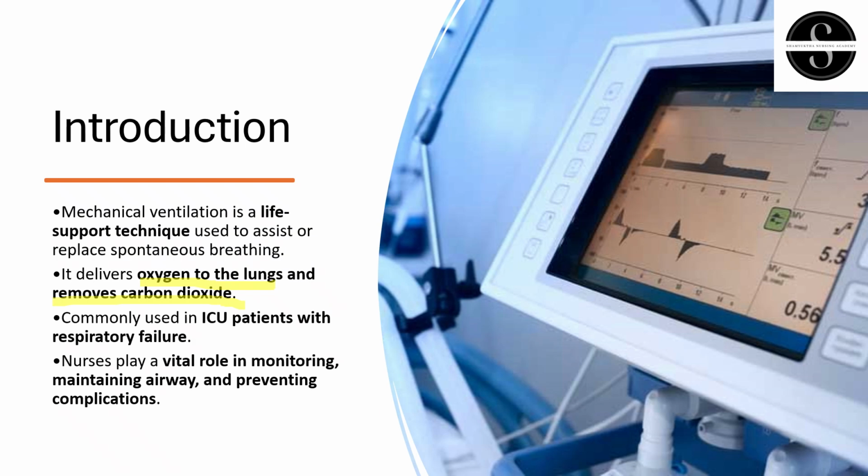It is commonly used in ICU patients with respiratory failure. In the ICU we have critical patients, right? Nurses play a vital role in monitoring the airway and preventing complications, and a major role in handling this mechanical ventilator. This is the simple definition and introductory overview of mechanical ventilation.